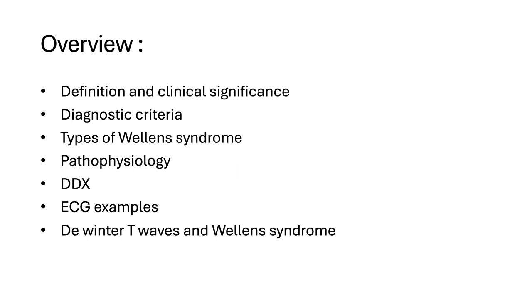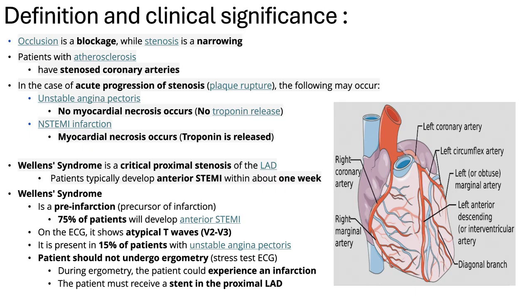Definition and clinical significance, diagnostic criteria, types of Wellens syndrome, pathophysiology, differential diagnosis, ECG examples, and lastly, the Winter T waves vs Wellens syndrome. So first of all, definition.